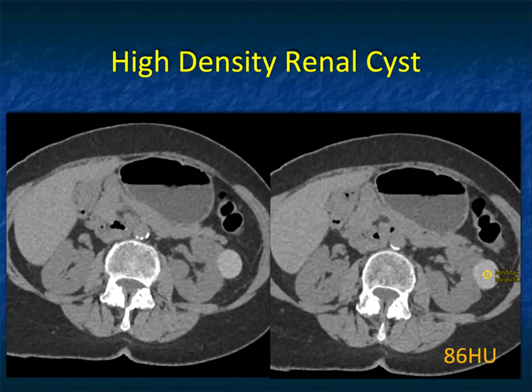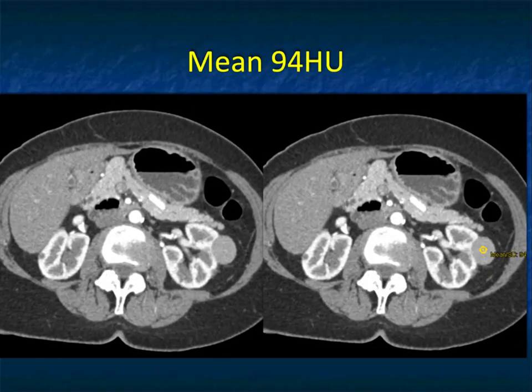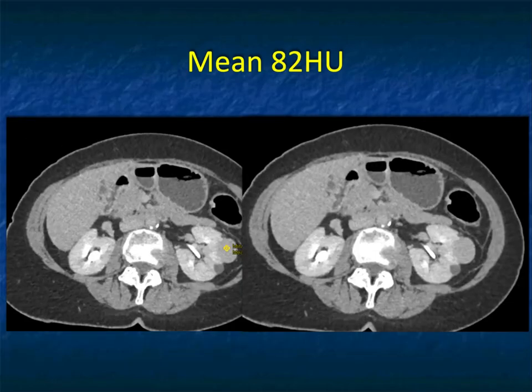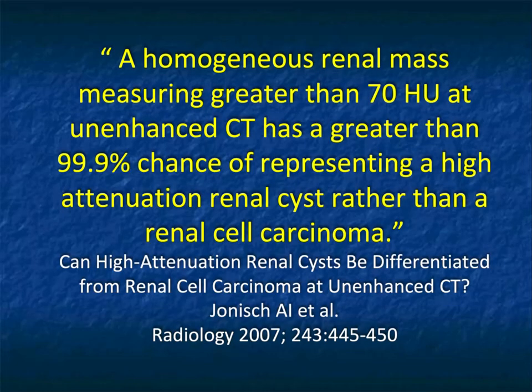Several rules: One — well-defined, over 70 Hounsfield units on non-contrast, it's always benign. Two — if you have a lesion like this, you have to say you're concerned about malignancy but recommend a non-contrast scan to be certain. Three — if a lesion doesn't change between two phases, there's a good chance there's no enhancement and it's a high-density renal cyst. The key is you don't want to miss any tumors, but you don't want to be over-calling things.